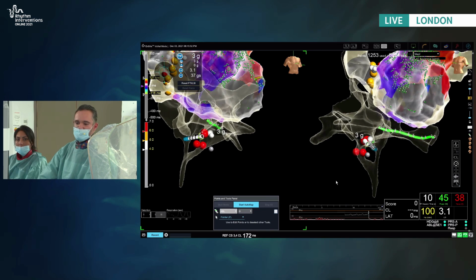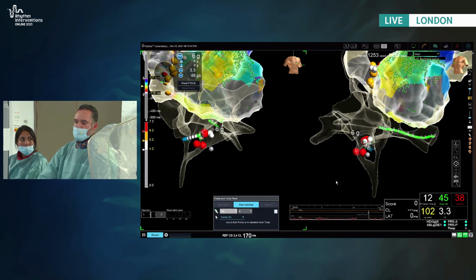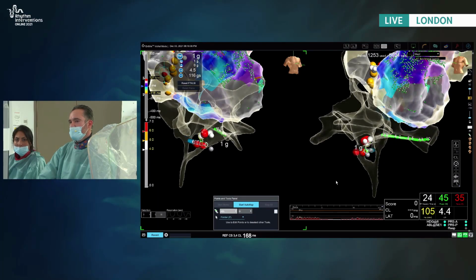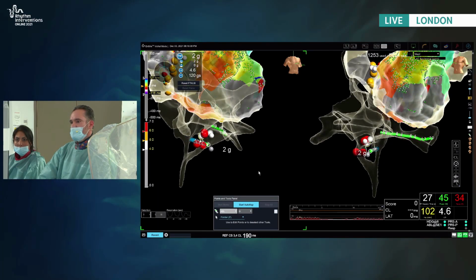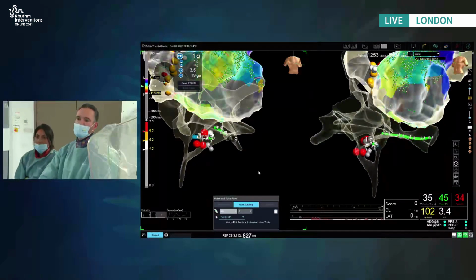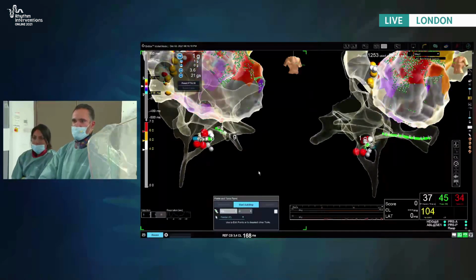It's just terminated. There's no cardioversion when you weren't looking. Well done. Yeah, I think if the activation's suggestive of it in the left atrium, and the signals in the right atrium suggest that you're just ahead of the coronary sinus catheter, and you're entrained from the CTI, to be honest, that's much more than I would have done normally, really.